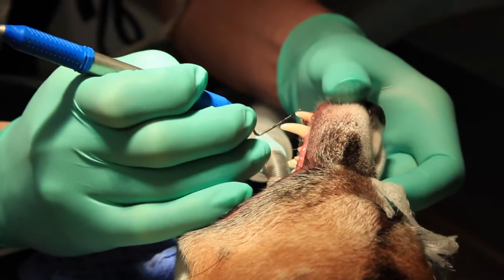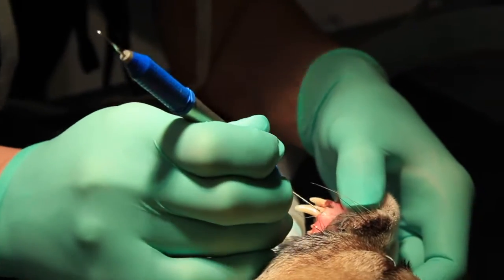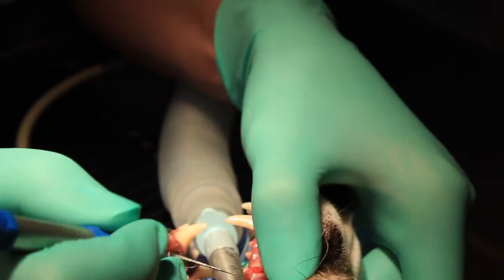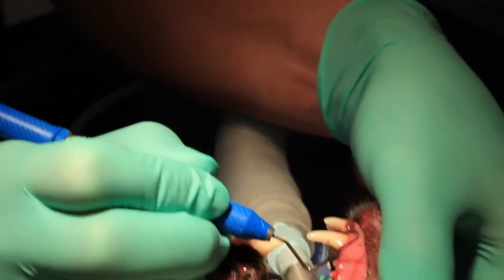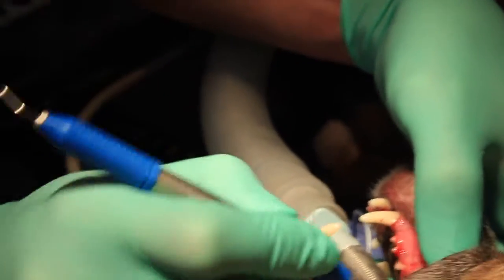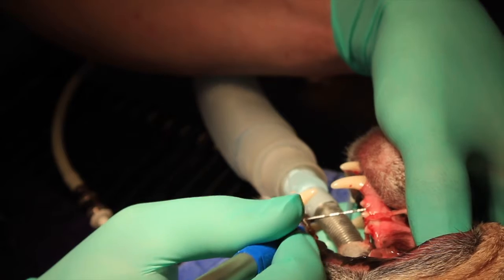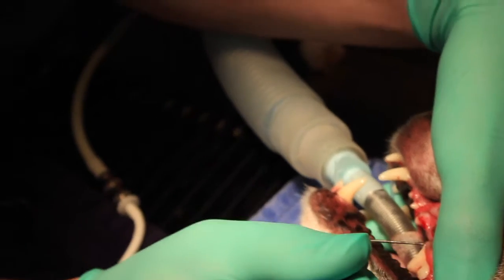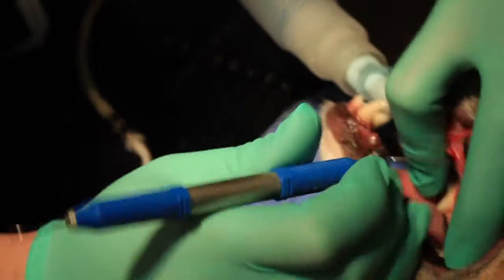We have a little enamel defect — a little chip — on tooth 203. Goose also has two of the same tooth right here: this is tooth number 204, so she has two 205 teeth, which is a unique abnormality. It's not causing her a problem so we're not going to remove it or do anything about it. She's also missing a tooth — she had two 205s, then 206, she's missing 207, and 208 is our big chewing tooth. Her teeth cleaned up nicely and so far they're probing normally, so she's not going to need any removed.